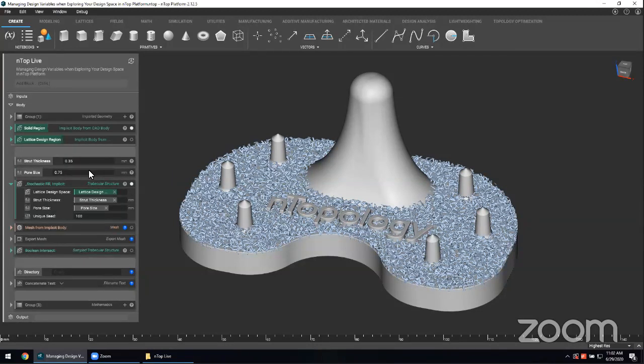It's currently set to 0.75 millimeters or 750 microns, and it's a characteristic commonly used to represent how porous or empty the lattice is. Now, in the context of orthopedic implants, the more empty the lattice can be, the more your bone can essentially grow into it and grab on tightly. Conversely, you may also want to make sure that the lattice is not too empty, so that the lattice as a whole can maintain structural integrity, with enough beams and with enough material.